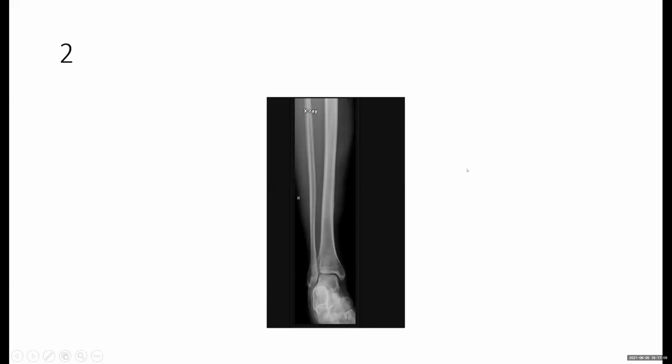Okay, so I'll go for the next one. Yes, please. Is this the next one? Yeah, this is the second one.